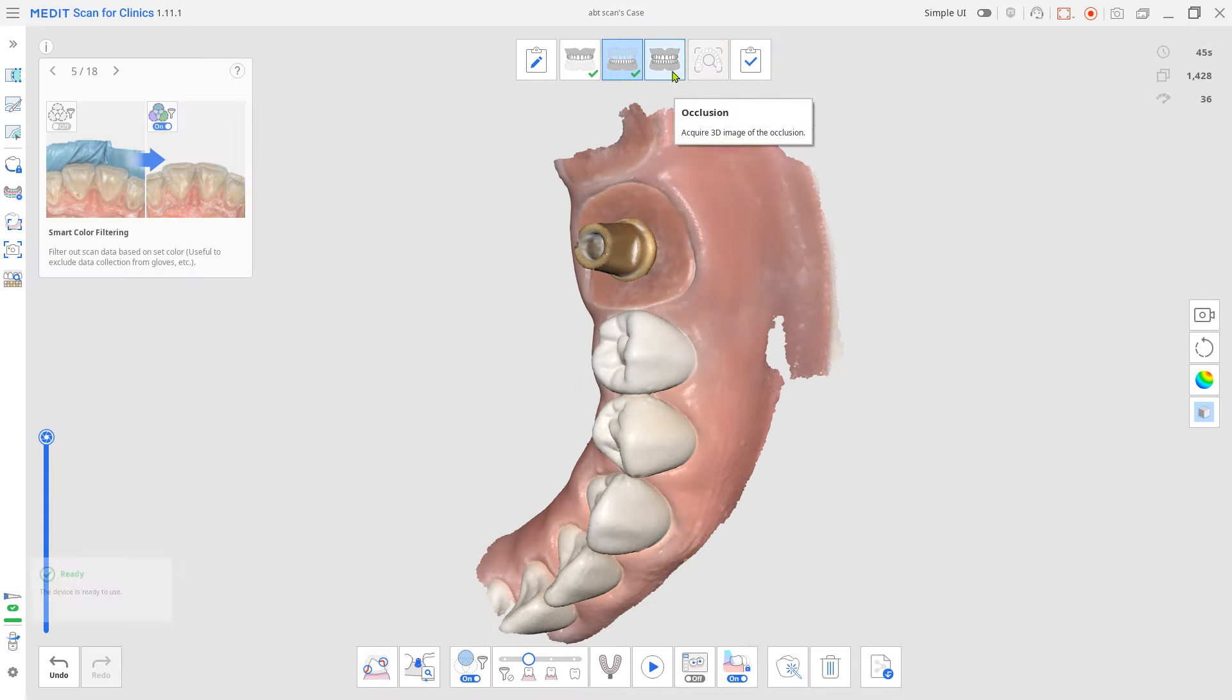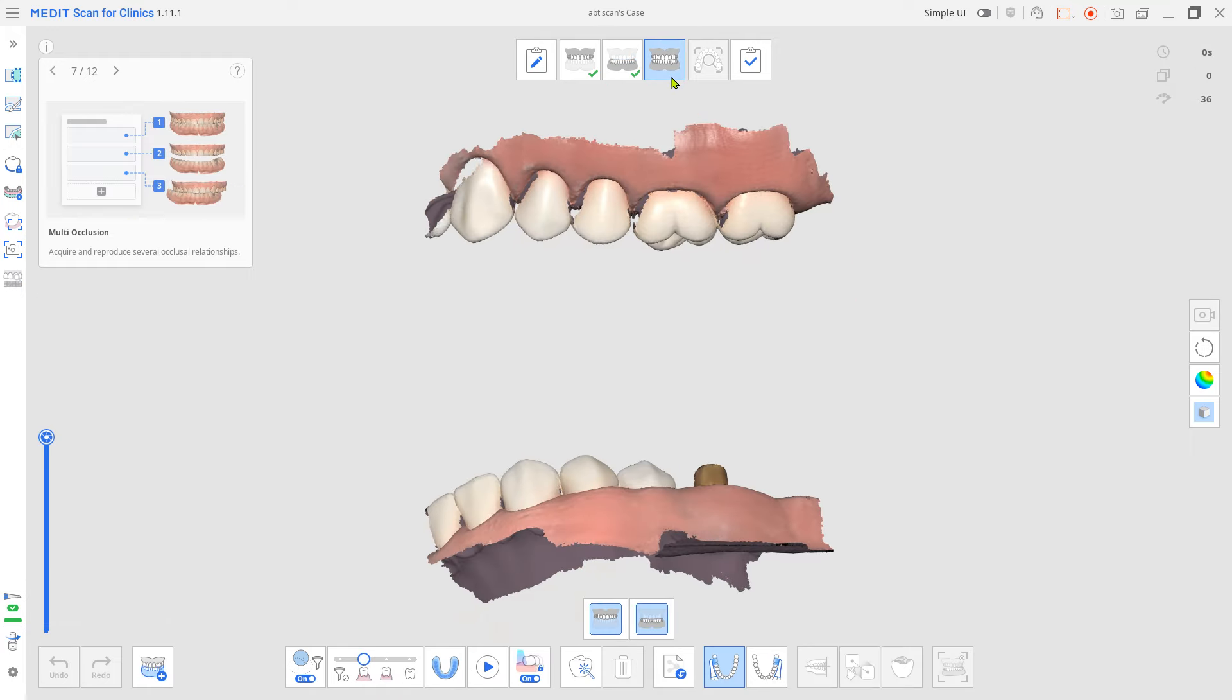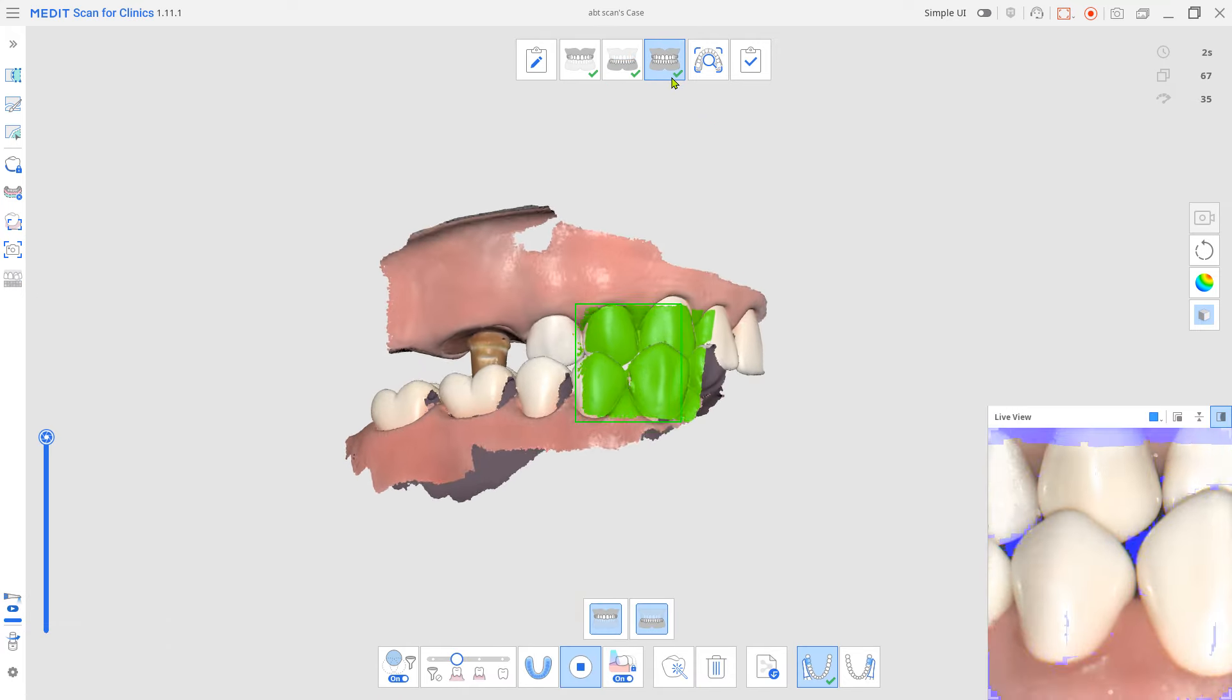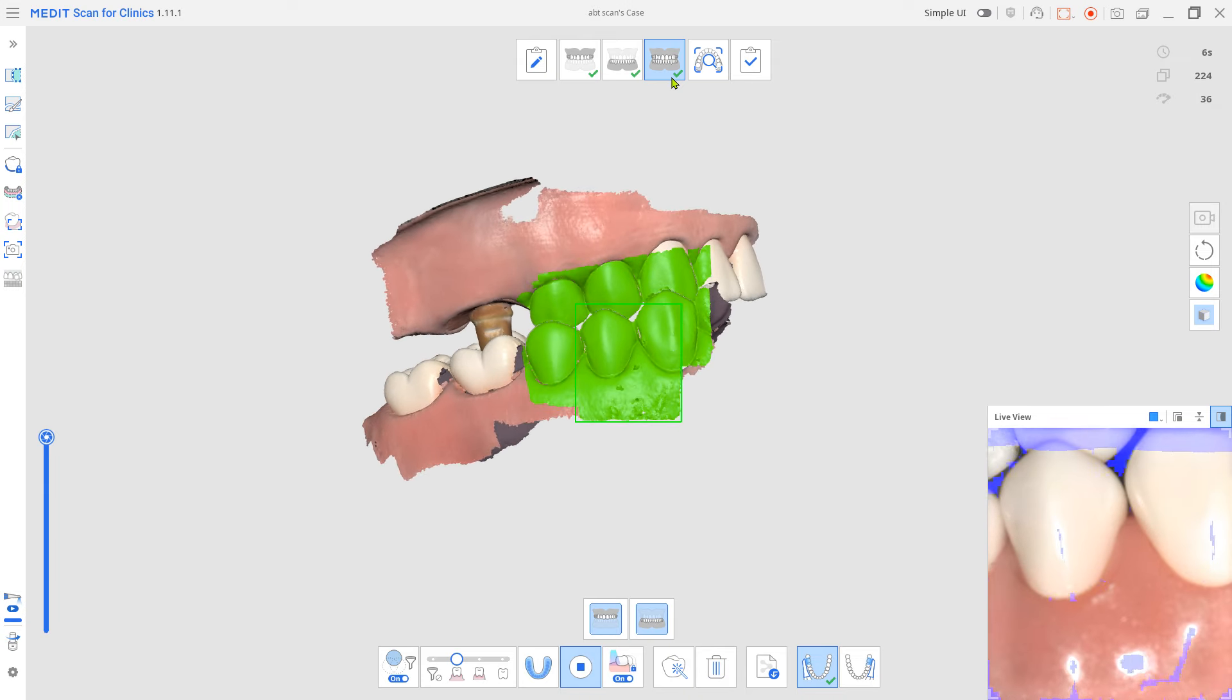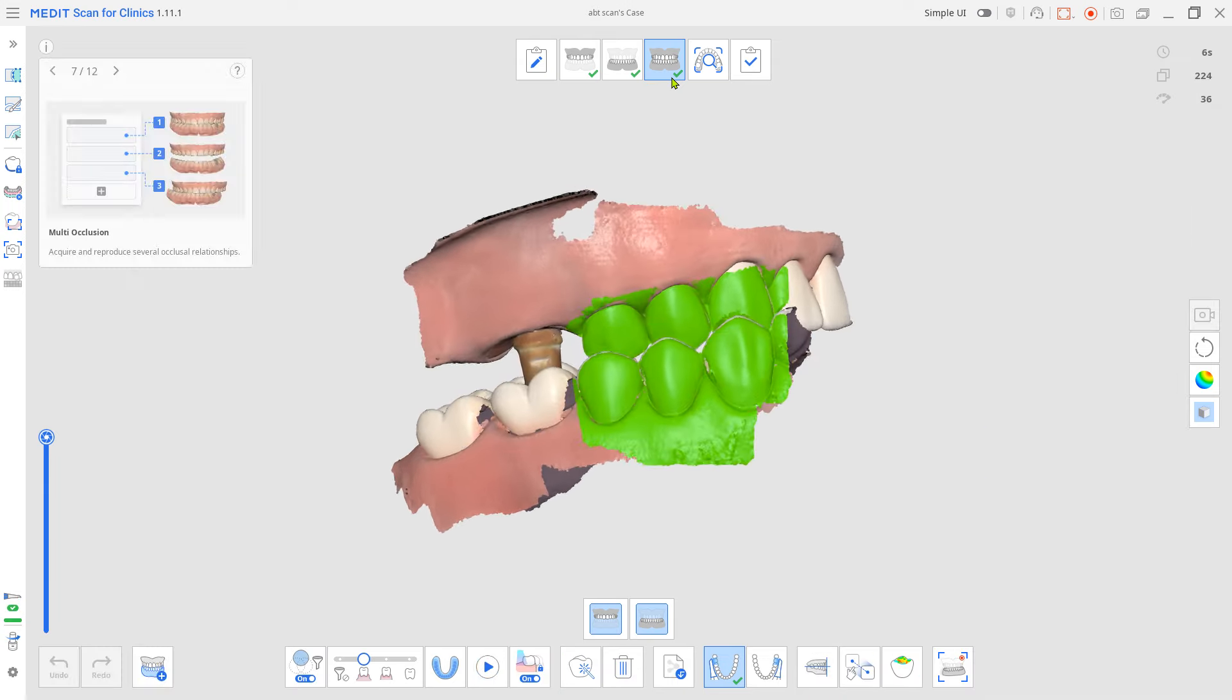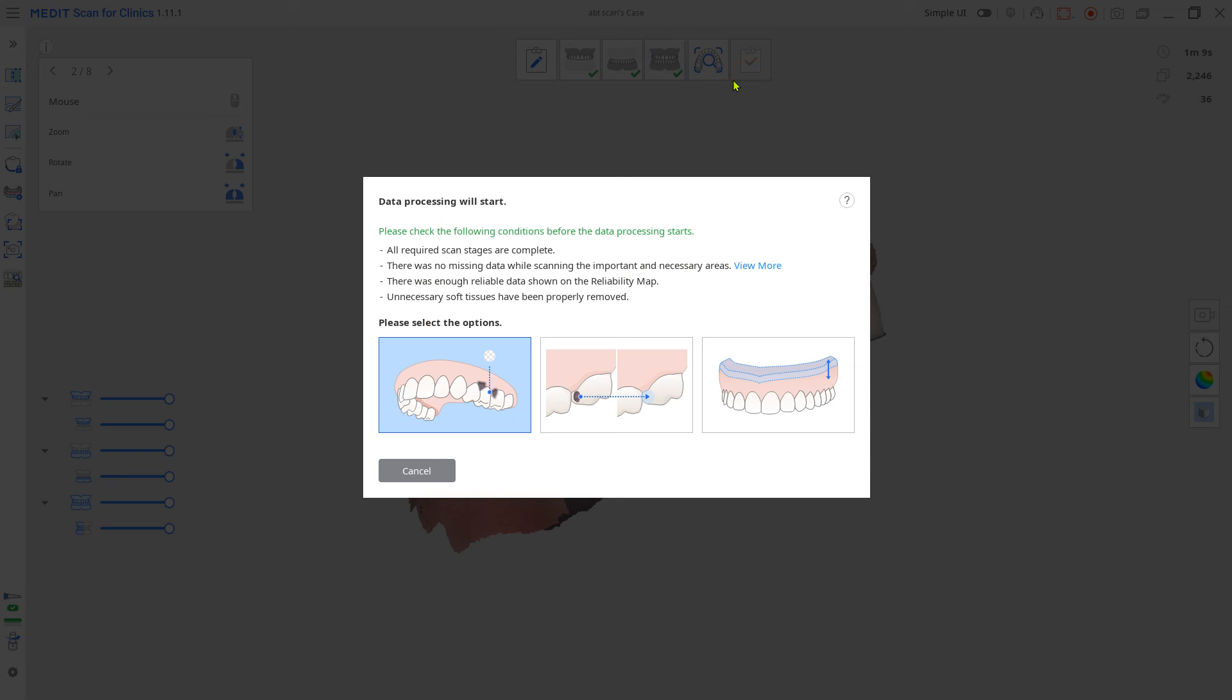Click complete to save. Have your patient close bite, then scan the occlusion. Click complete to save. Choose as is.